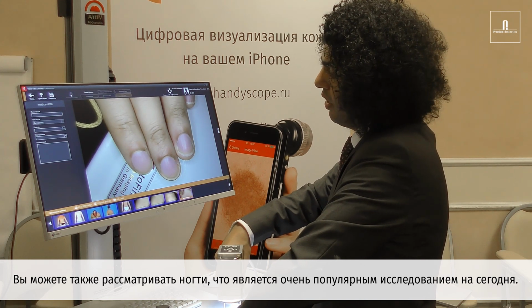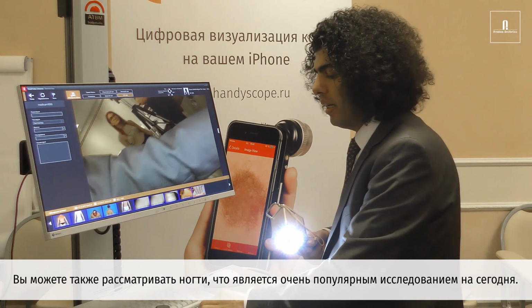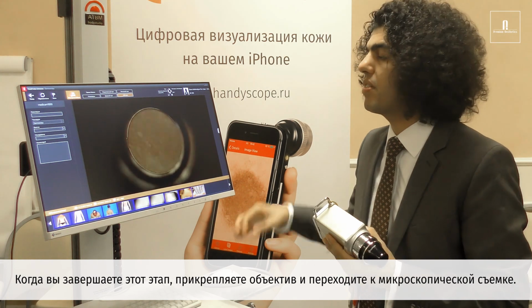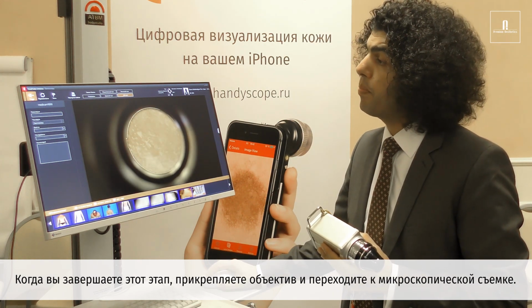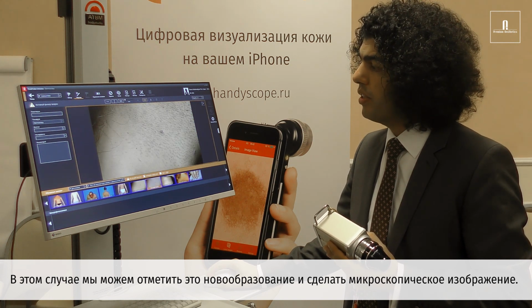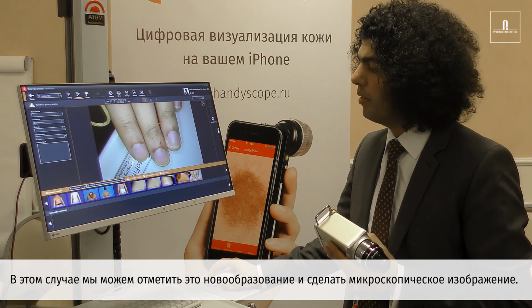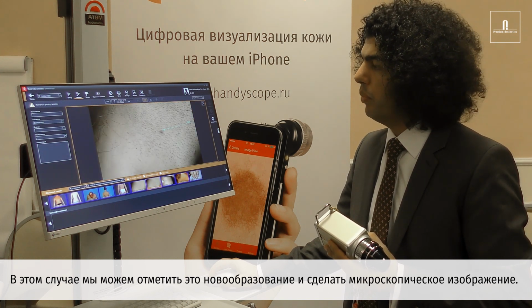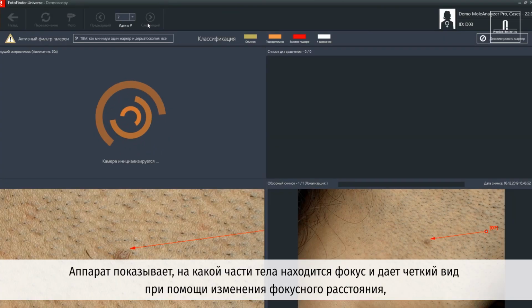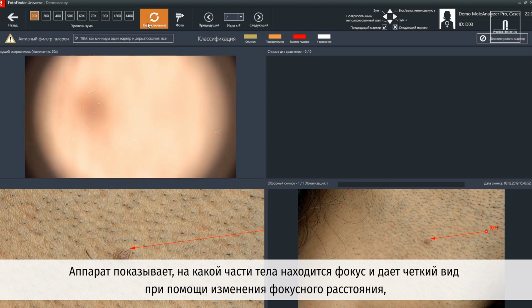So at the end of the day, you have the possibility to do standardized photography with the distance holder. When you finish with that, we can easily connect the lens and then start doing your microscopic photography. In this case, we could basically mark this lesion. We could mark, let's say, this one, and we can just do microscopic imaging. What I like about it is the logic. It shows you exactly where you are, which part of the body you are.